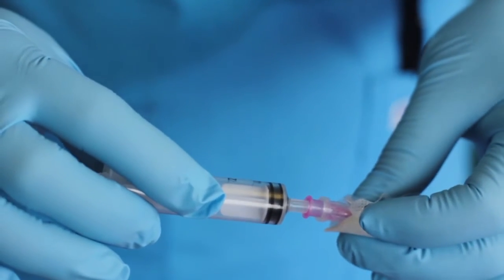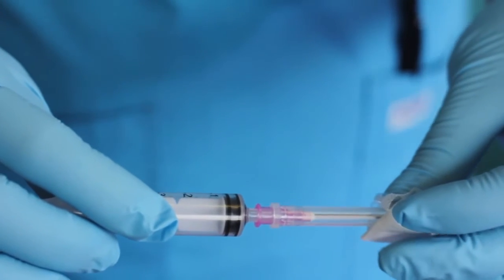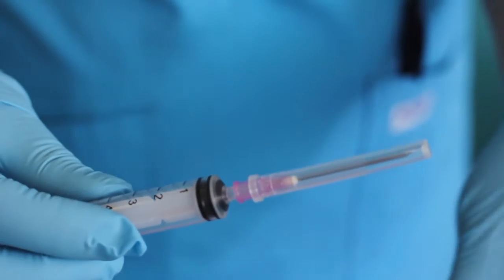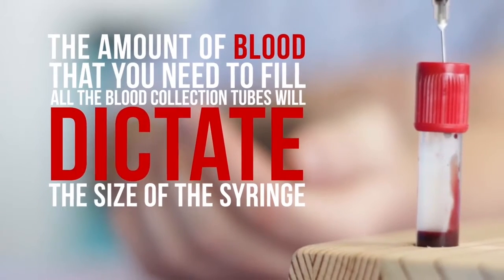Attach either the AutoSafe Reflex Safety Needle or a regular needle to a 5 or 10 milliliter syringe. The amount of blood that you need to fill all the blood collection tubes will dictate the size of the syringe.